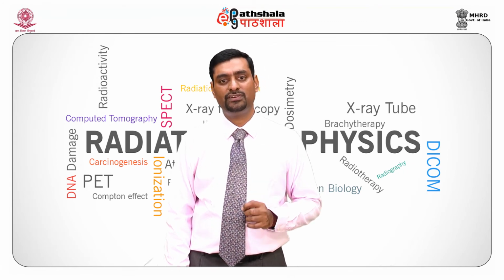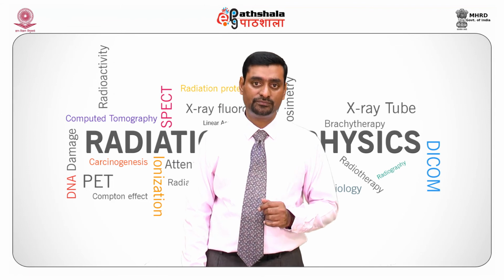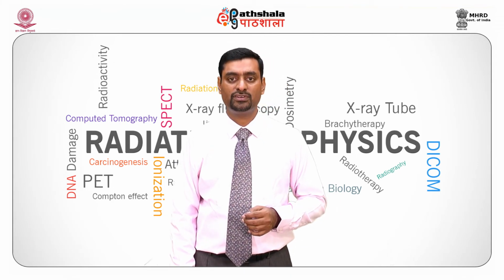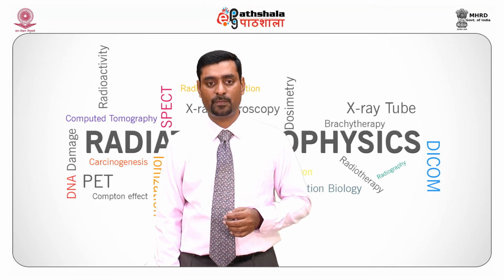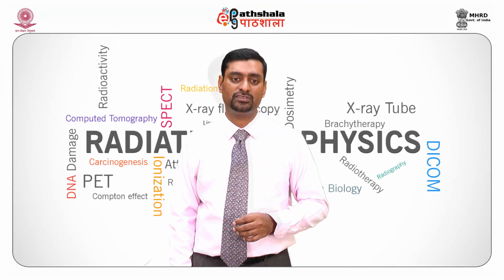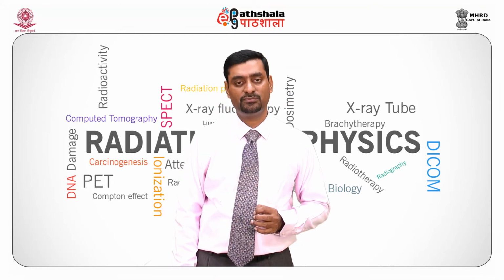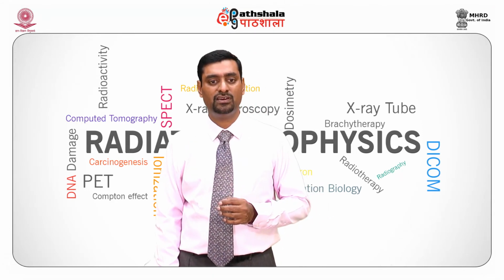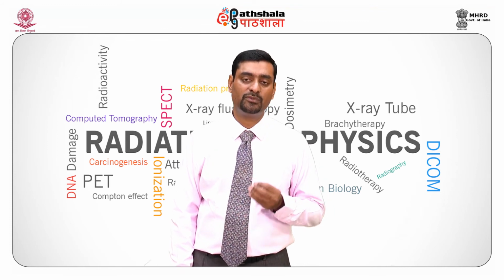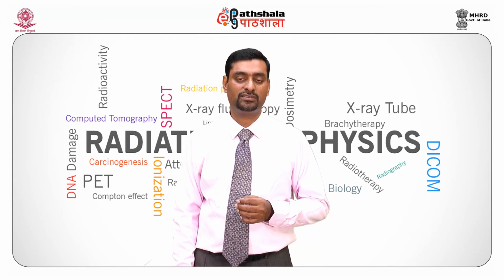The activity of the fixer agent increases with temperature. So, when we use high temperature, it speeds up the process of diffusion in the emulsion containing gelatin. It is also more susceptible to damage when you go for very high temperatures. A higher temperature difference between developer and fixer may result in films suffering emulsion damage. Something like breaking of the emulsion takes place in the film.